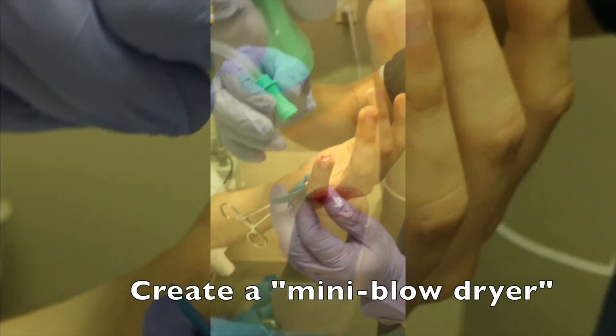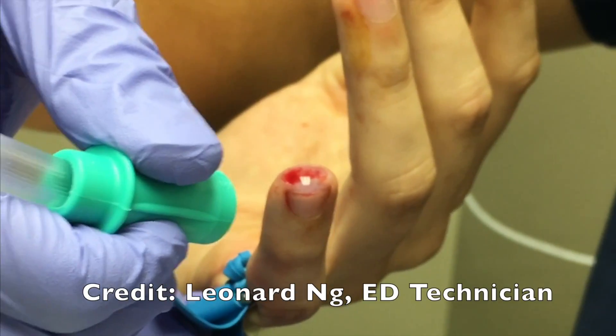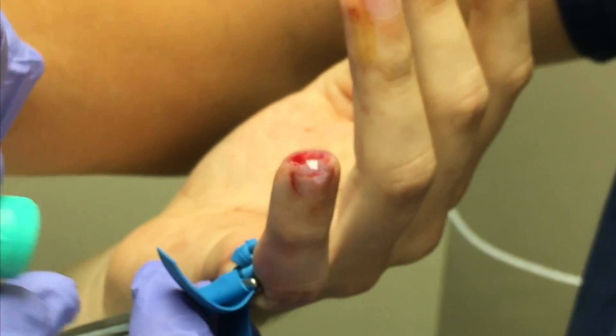Take a piece of suction tubing, attach it to your compressed air source, and create a mini blow dryer, which you can apply to the wound in order to speed the drying of that glue.